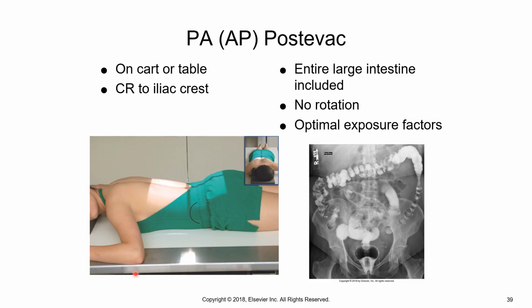Your technique on this is the same as when you started. You're at 110 at 2 for single, 90 at 2 for double or water soluble. And this would be annotated with post-evac. You're on a 14 by 17 open, so you're opened back up on this. Patient is either on their stomach or on their back. Your central ray is perpendicular to iliac crest and midline.